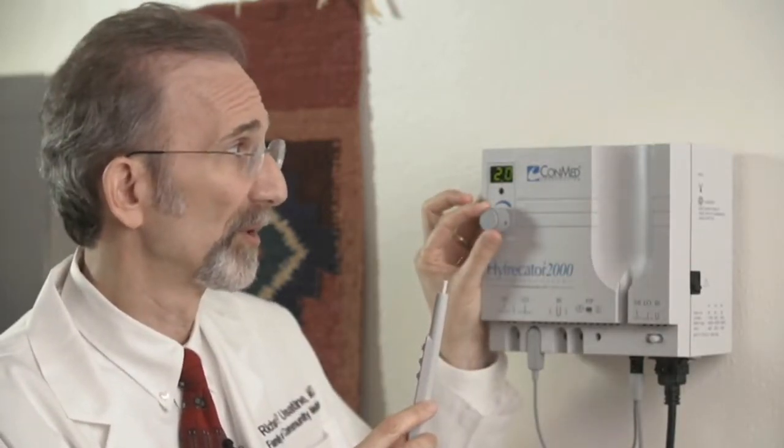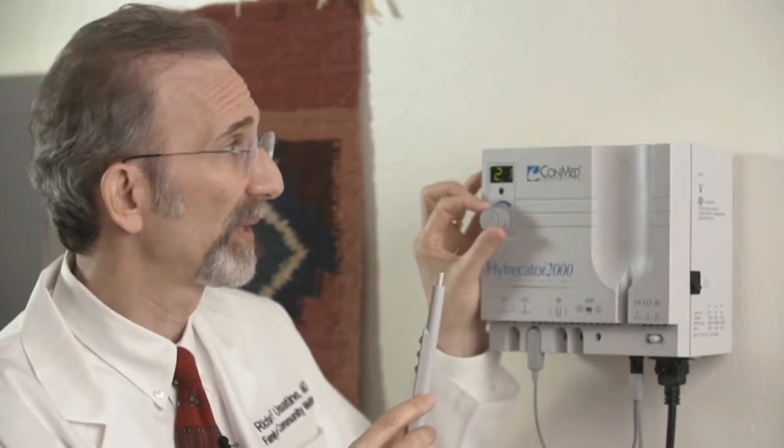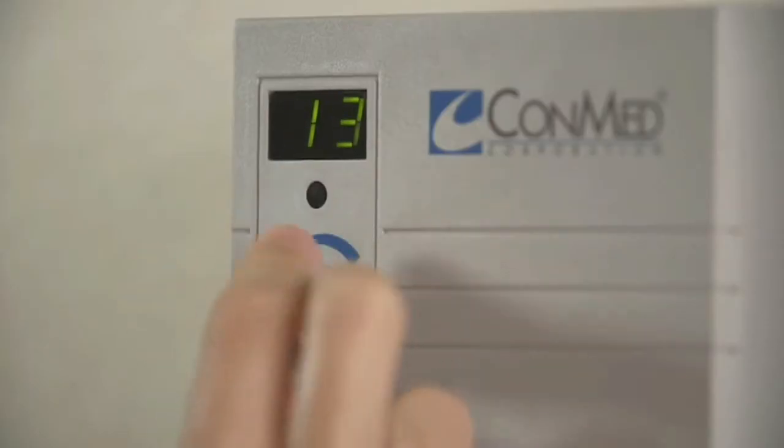On a lot of our procedures without anesthesia, we use 2.0 or 2.1, and then we can go all the way up with a maximum of 20. This is what I use for something like a pyogenic granuloma.